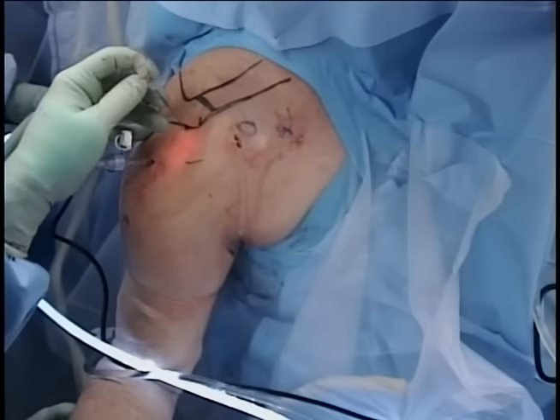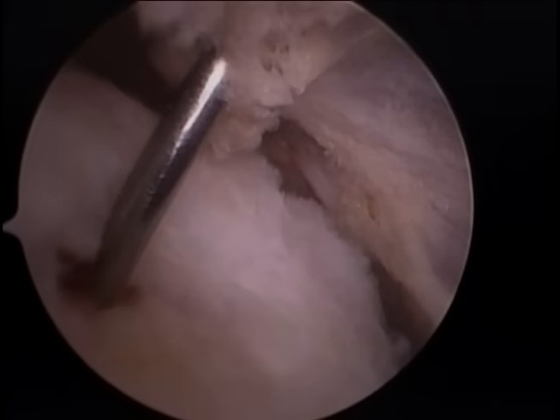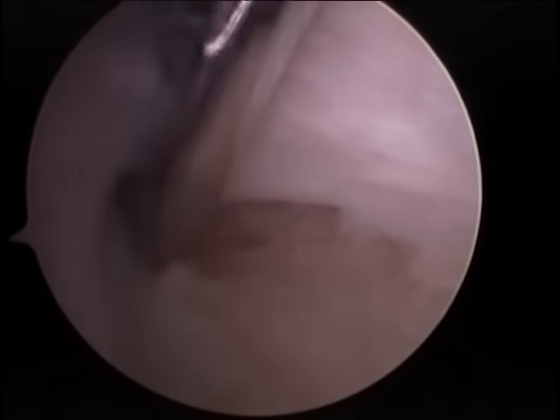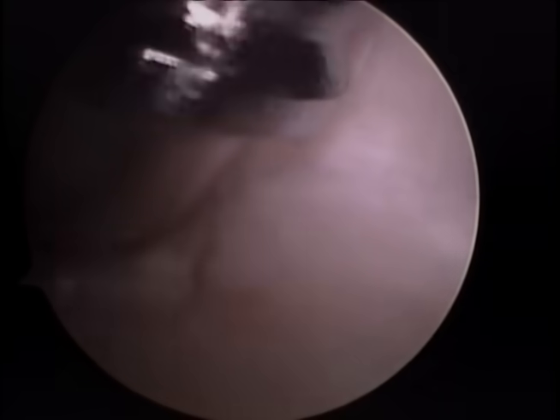We must now localize the correct angle of approach for our anchor. In the subacromial space, we confirm the spinal needle location. We make a nick in the skin and insert our punch to make a pilot hole for the anchor. We find the correct spot in the tuberosity, and then we mallet this punch down to the black line that lets us know how far to go. Once our punch is all the way down, we insert a tap to prepare the bone for the anchor. The small yellow globules you see are fat from the bone.